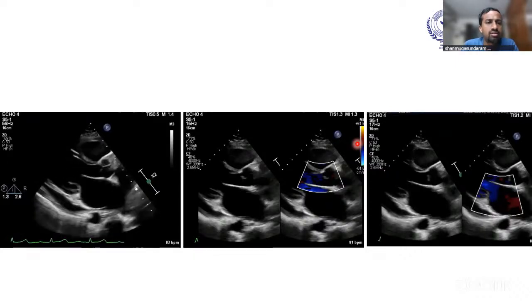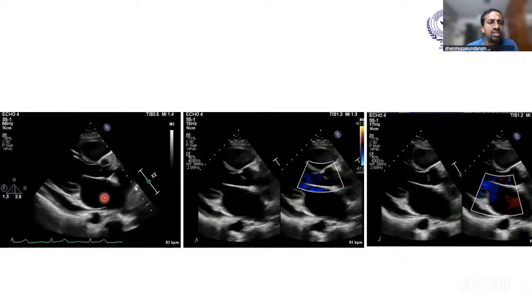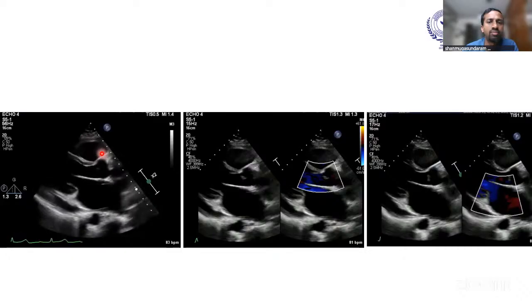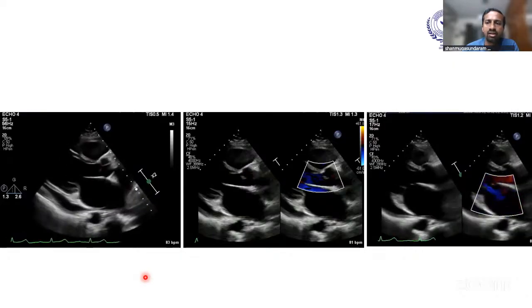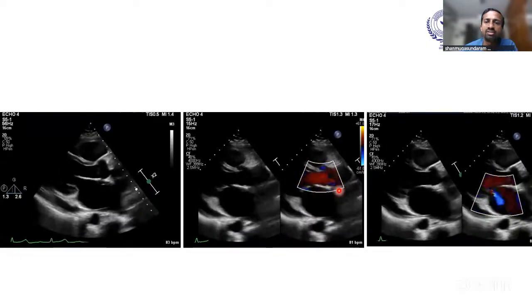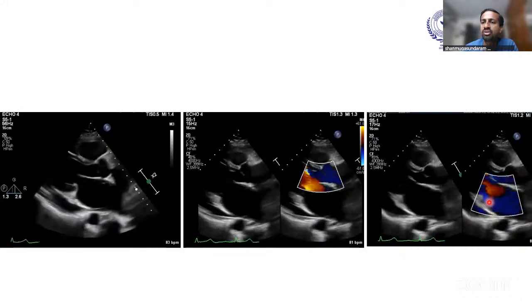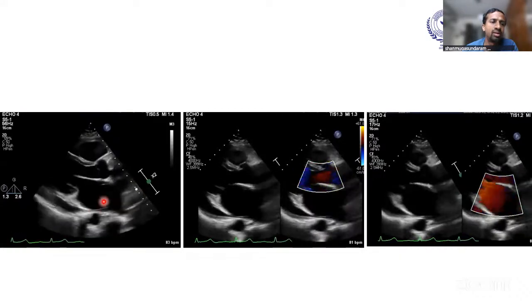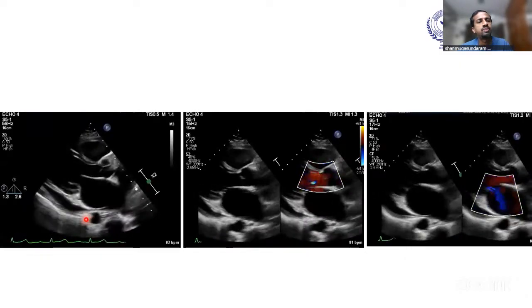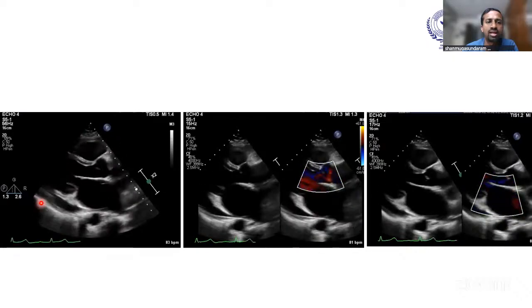To continue with the echocardiographic images, this is the parasternal long axis, which shows normal ventricular dimension and systolic function, and left atrial enlargement is noted. The mitral leaflet and aortic valve were morphologically normal, and the aortic root dimension appears normal. On color across the aortic valve, there is no evidence of turbulence in the LVOT. There's a trivial aortic regurgitation. There is no antegrade turbulence across the aortic valve. There is mild mitral regurgitation noted with a jet directed centrally. The other prominent finding noted here is the pericardial collection, which is noted posterior to the left ventricle, and there is some collection noted anterior to the RV as well.